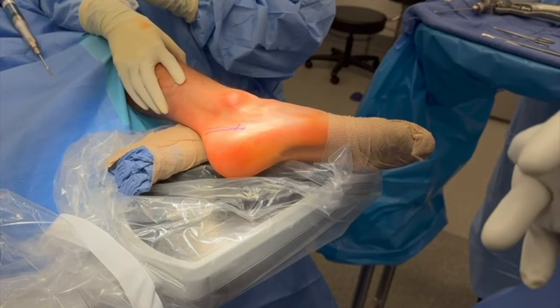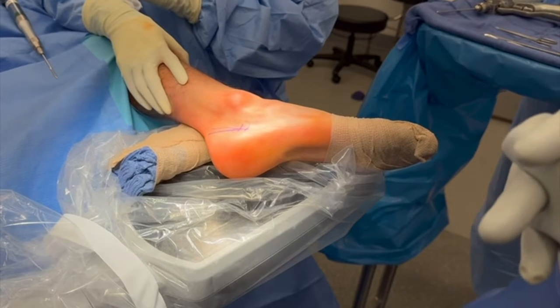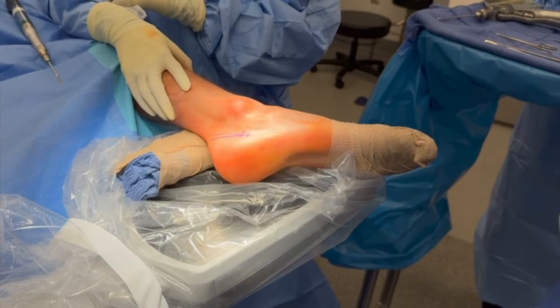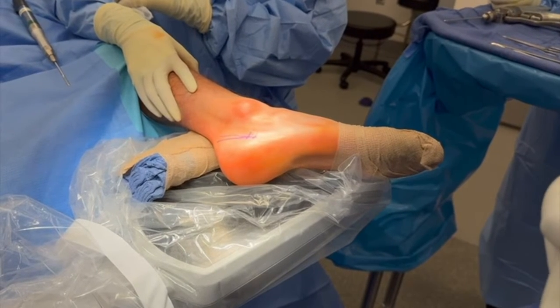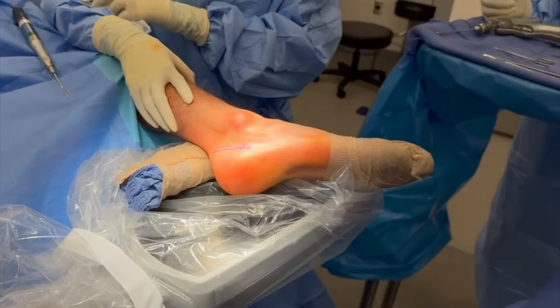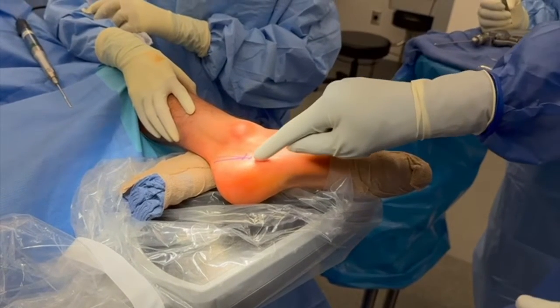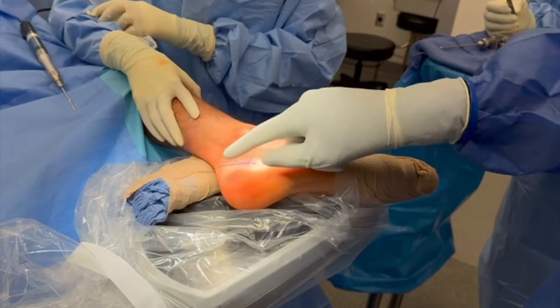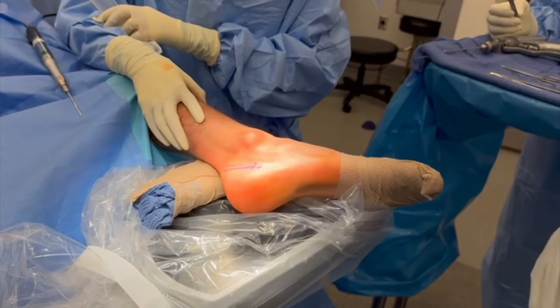This is the percutaneous calcaneal dorsal closing wedge Zadek osteotomy. The patient is positioned in the beanbag lateral position with an axillary roll, with the entire foot resting on the mini C-arm. We've marked our plantar incision, which is at the apex of the osteotomy, as well as our wedge, which measures about a centimeter dorsally.